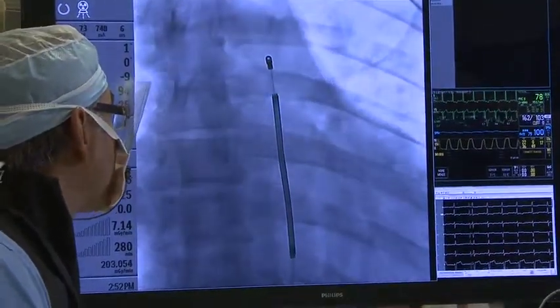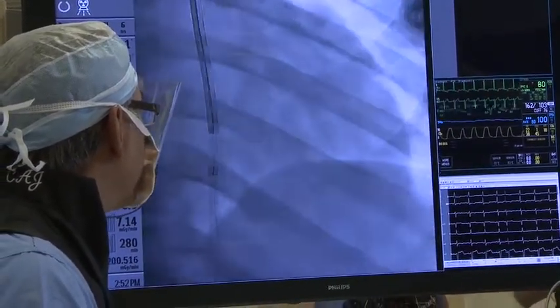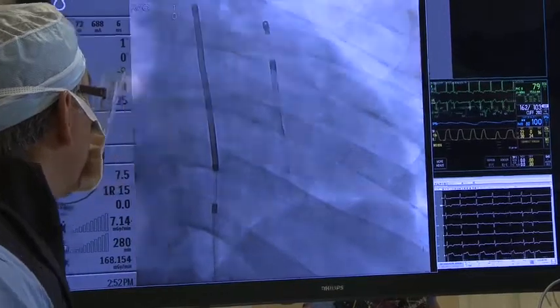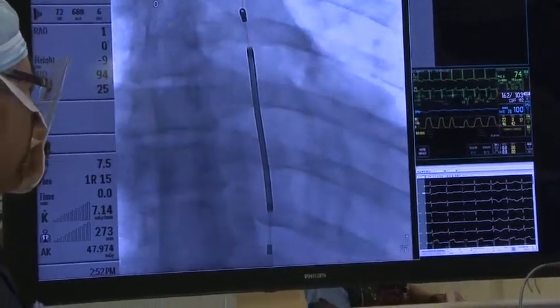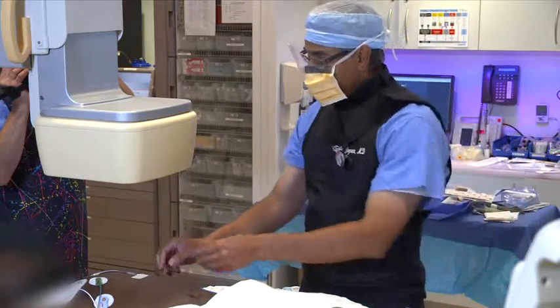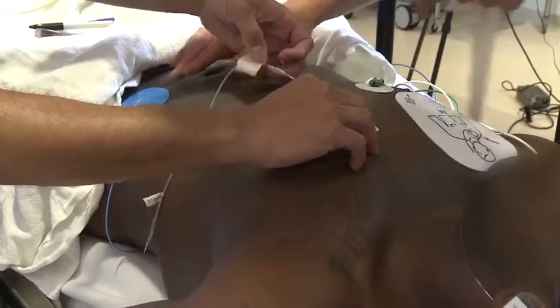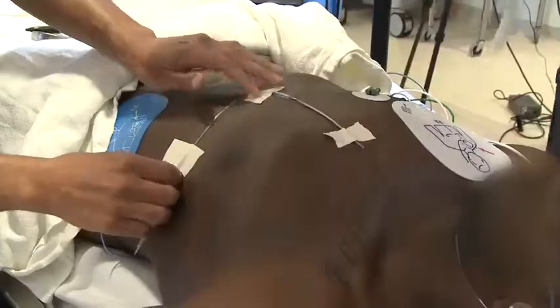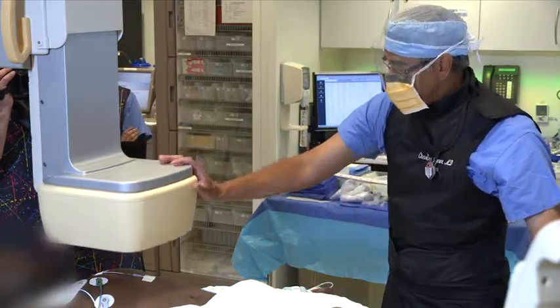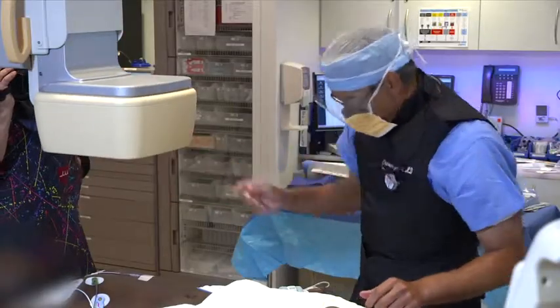Let me move the table a little bit. You can see the diaphragm there, getting an idea of where the heart ends, and here's the lateral aspect. Looking at this, it's not bad, but I'd say I've got the lead a little bit more towards the suprasternal notch than needed. The distance from the sternum is okay. Let me manipulate this just a little bit — some time spent here goes a long way toward making sure the device functions properly. Let's take another look.